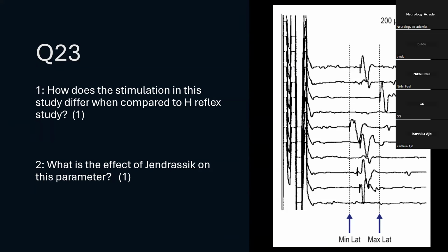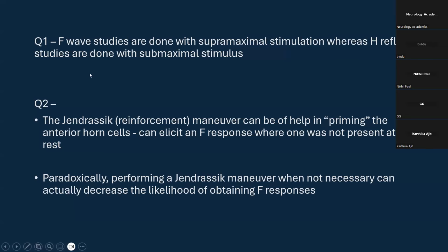How does the stimulation in this study differ compared to the H-reflex? So this is an F-wave study, and how does it differ from the H-reflex in terms of stimulation? F-wave studies are done with supramaximal stimulation, whereas H-reflex studies are done with submaximal stimulus.